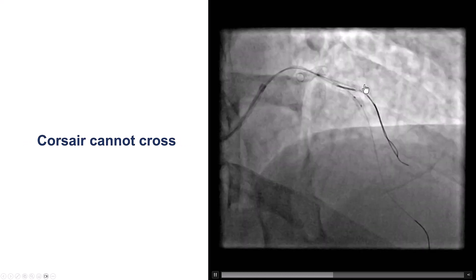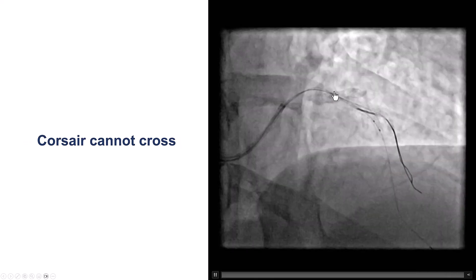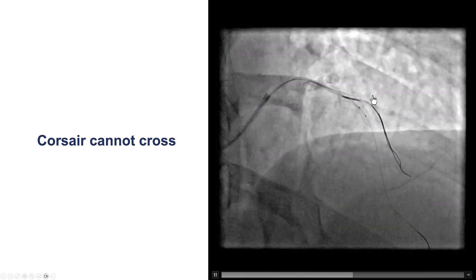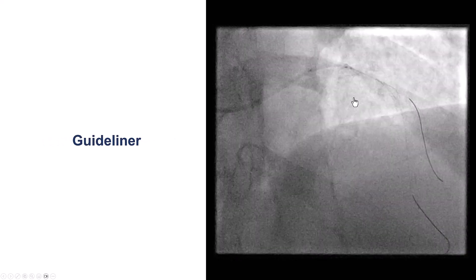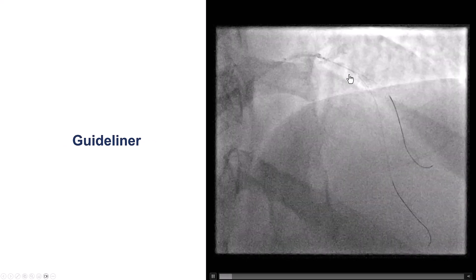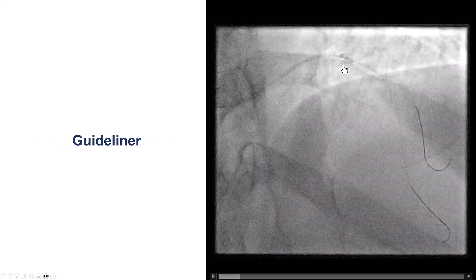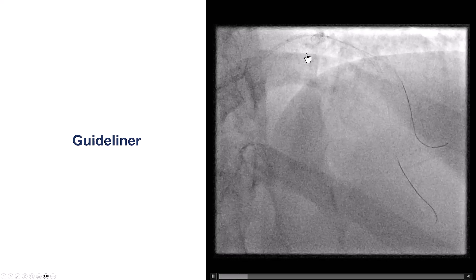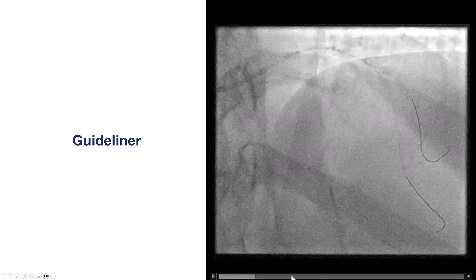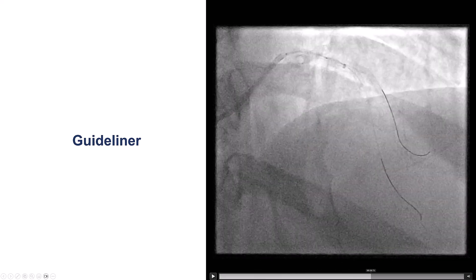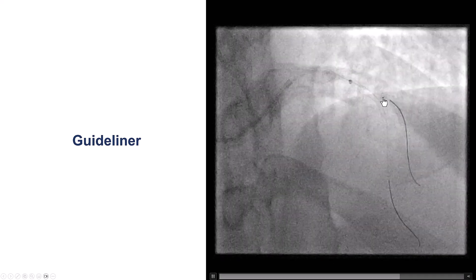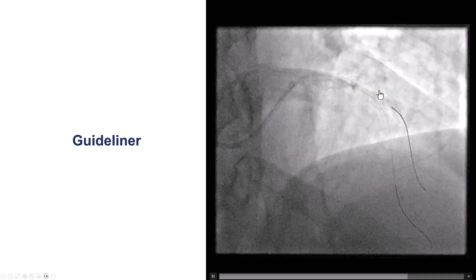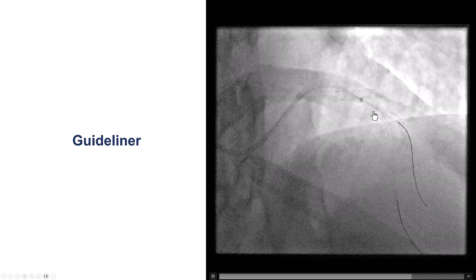However, we also could not get a 1.0 by 15 millimeter Sapphire balloon through. We then used a guide extension, and by advancing the guide extension close to the origin of the diagonal — essentially almost all the way — we were then able to advance the balloon into the diagonal branch.